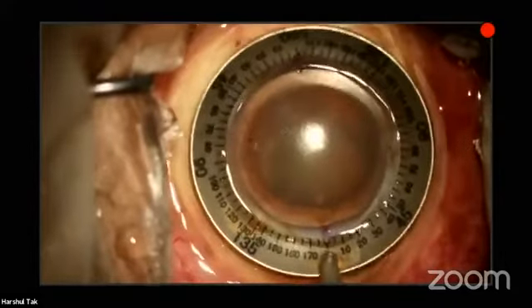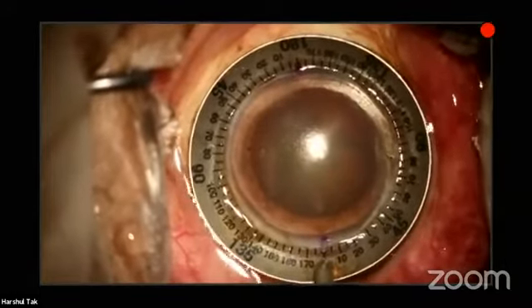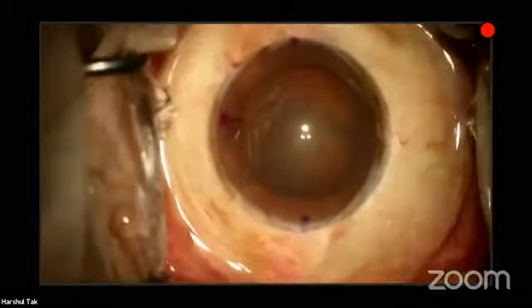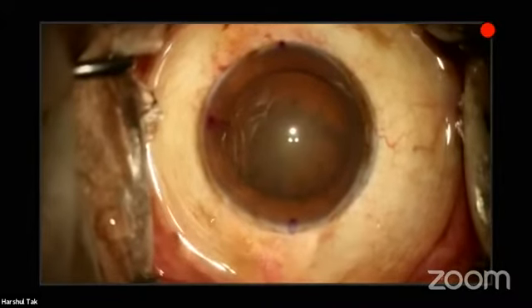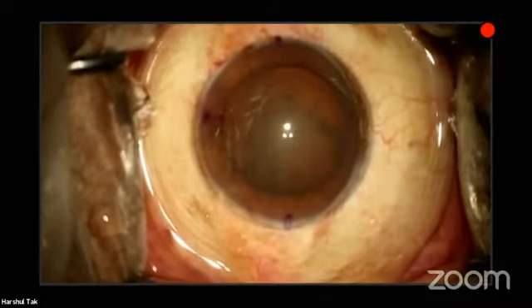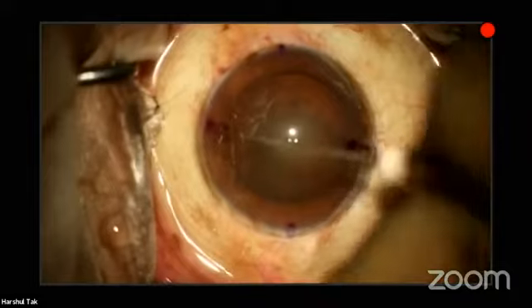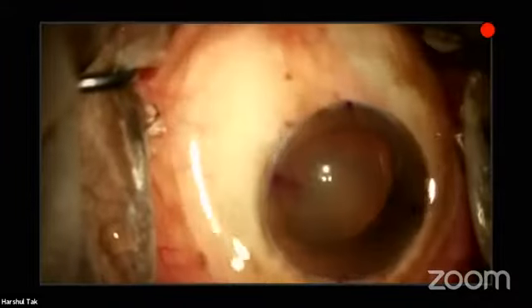So that these marks are very thin. So always go and mark first with this thin 26 gauge needle and not directly with the ink pen, so that they don't extend. So these are the two marks at 79 degree. Can you give me the needle again, please? Needle, yeah, with ink. So this is the axis of the implantation for toric IOL. And this again, I'm just extending it. So this is the 79 degree mark. After that, we just wash away the excess.